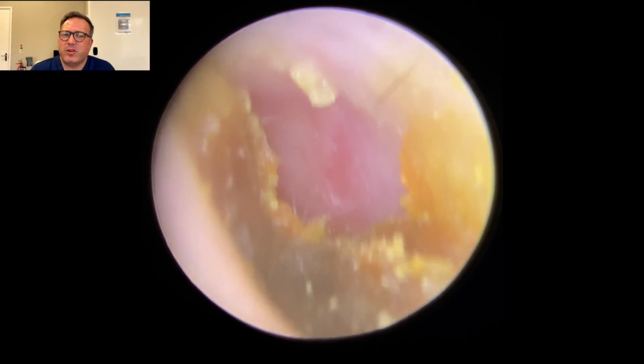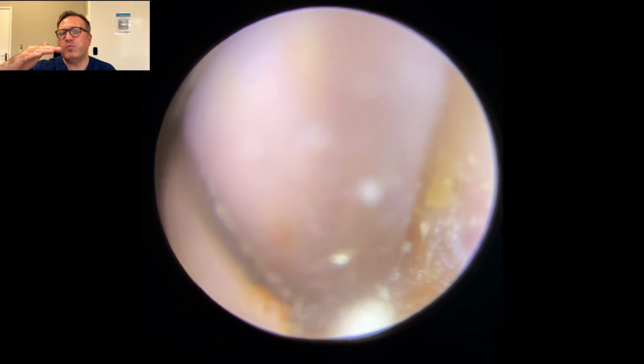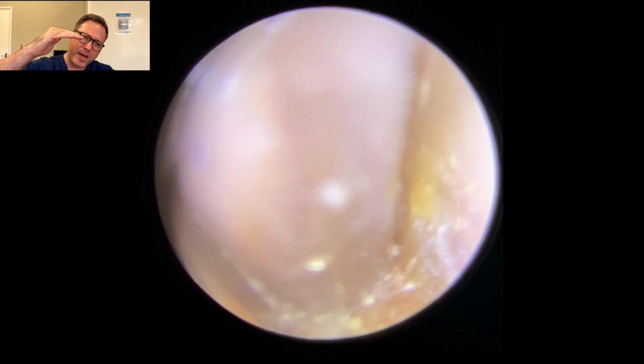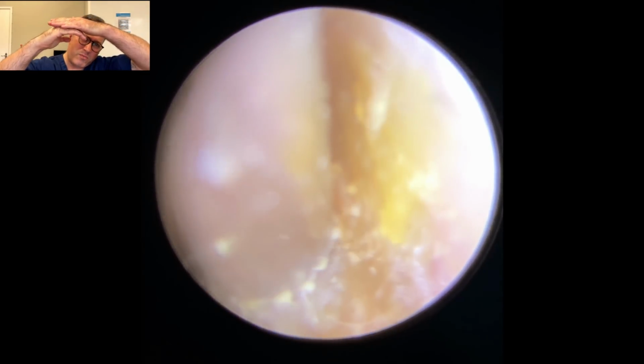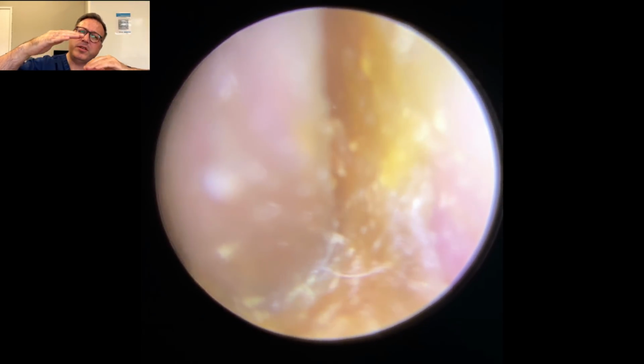So yeah, not an easy type of wax to work with. But now we've taken that section away from the top, it means that we can get more of a lift to the bottom section, because that top portion of wax isn't butting up against the roof of the canal. So as you're lifting, you've not got much clearance. But when you take that central section away, it means you've got a lot more clearance.